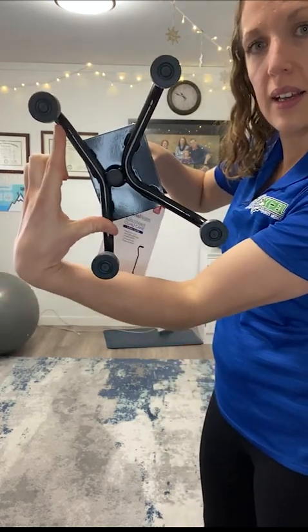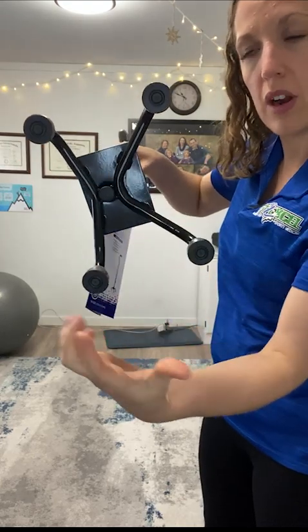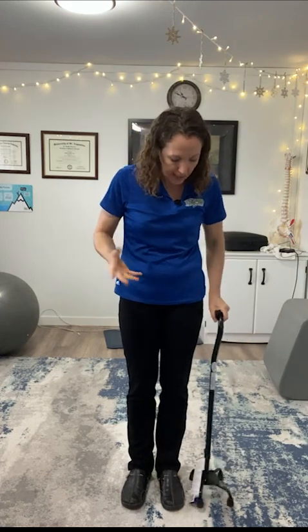Notice that this side is flatter and this side juts out a bit more. You want the flatter side towards your body, so this is set up to go on this side of my body so that I'm not bumping into those feet that come out wider. That's the idea behind that.